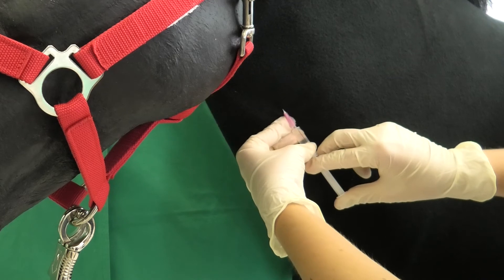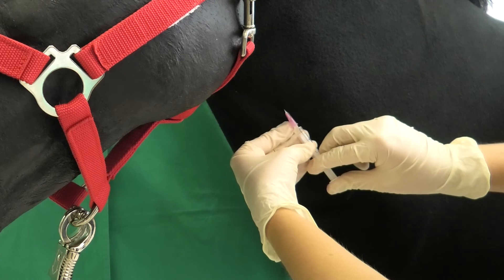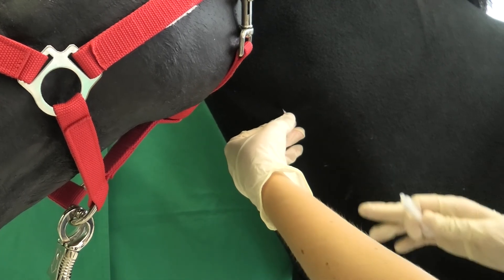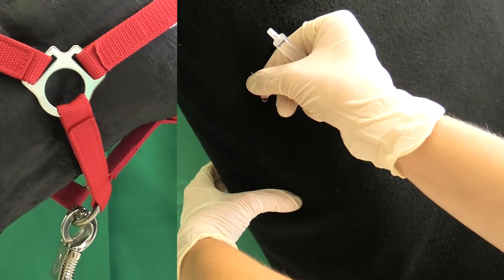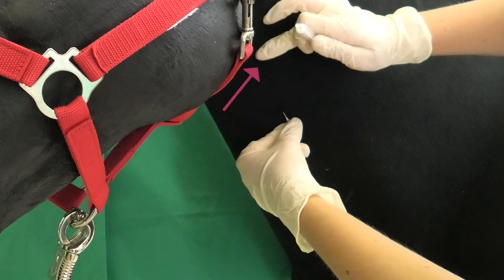The drug can now be slowly injected into the vein. After the drug has been fully injected, the vein is now congested towards the heart. The syringe is removed from the cannula. So that no remainders of the drug in the cannula get into the surrounding tissue when pulled out, some blood should be allowed to drip out of the cannula. The puncture site is then blocked towards the head without pressing the cannula tip into the endothelium of the venous wall. This prevents the formation of hematomas and damage to the endothelium.